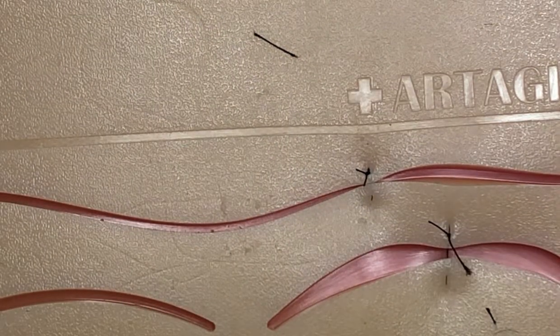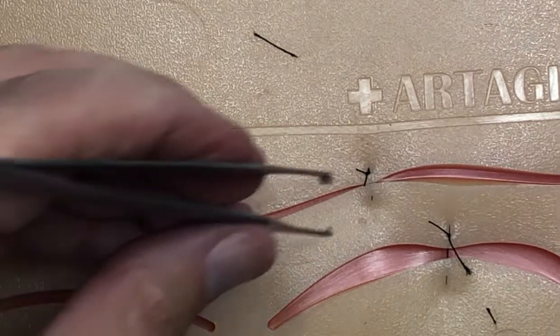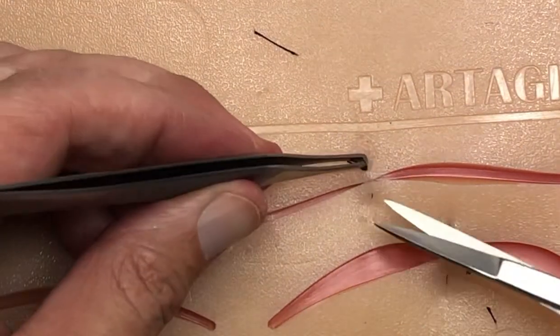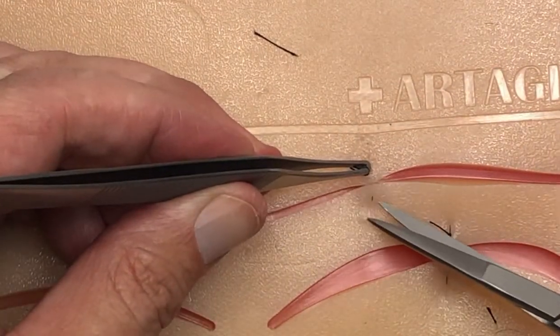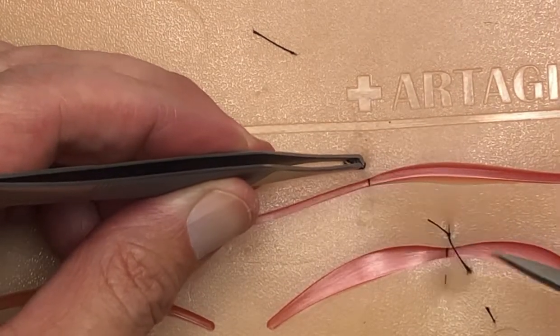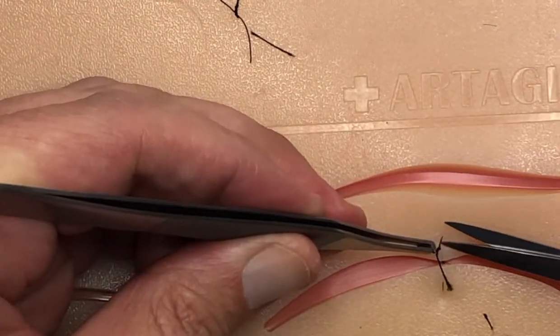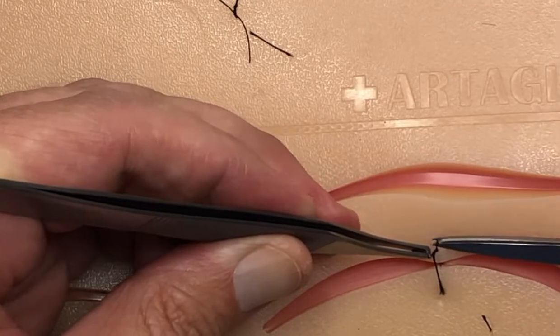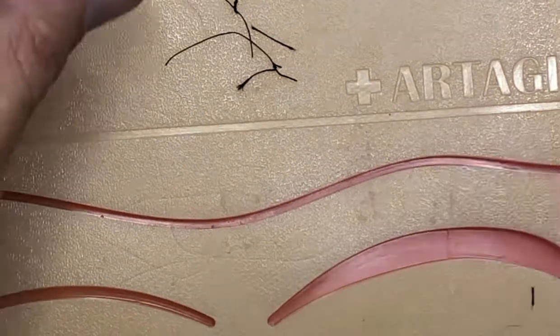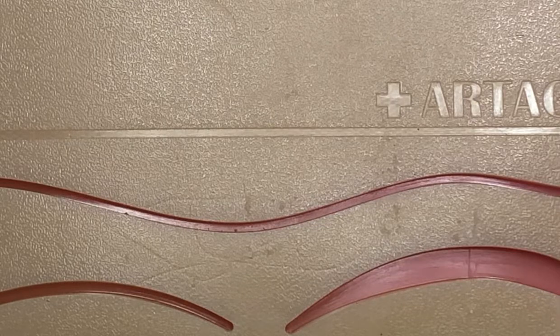There we go — now we've got two vertical mattress sutures. Great stitch to have at your disposal. To remove these, you can take your suture scissors and go right down where that stitch is, snip, and it pulls out. Alternatively, you can come over on the side where the knot is if you feel more comfortable, snip, and pull out. Alright, there we go folks — the vertical mattress suture.